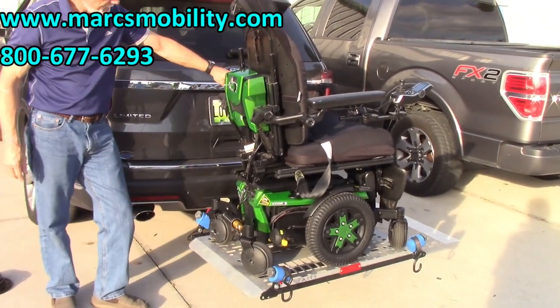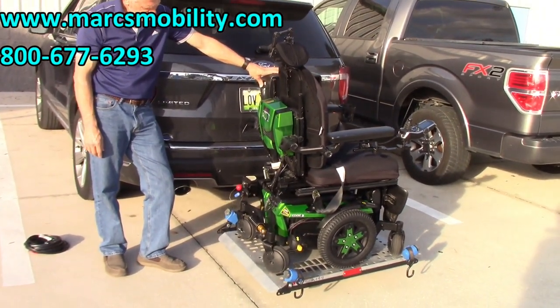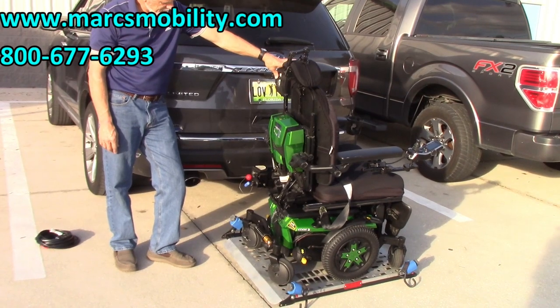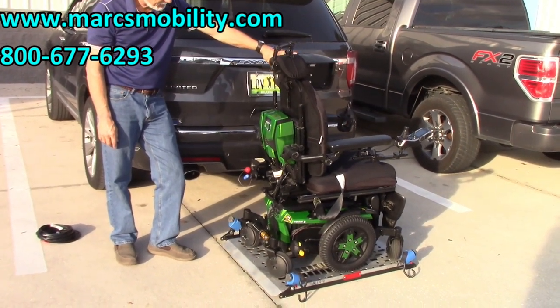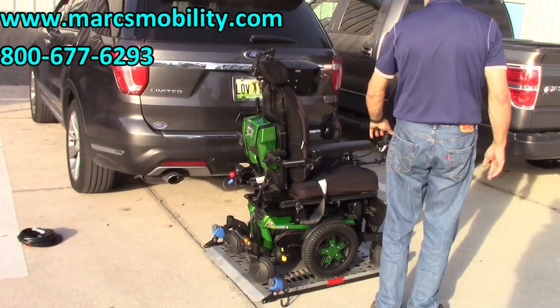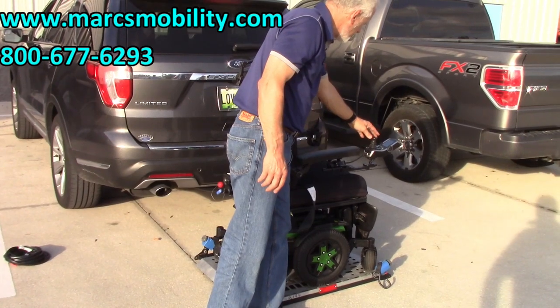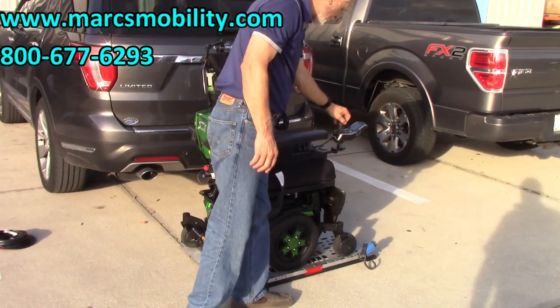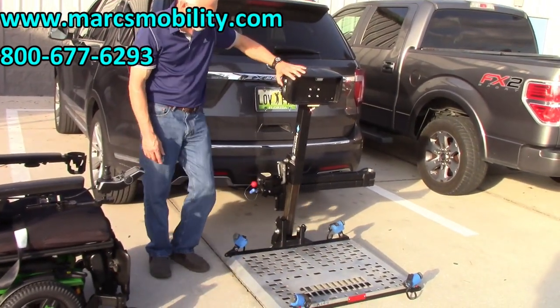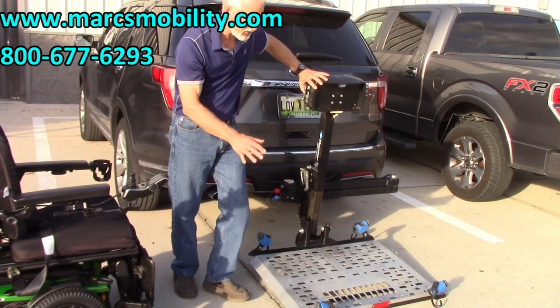Now we're going to bring the lift down. You can bring the chair off either way — front or back. When you raise the lift back up, do not leave the platform down if you're at a store, because someone is going to ride over it for sure. Always make sure you put it back up.